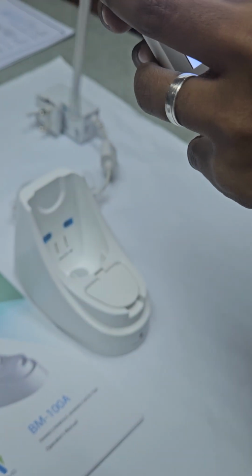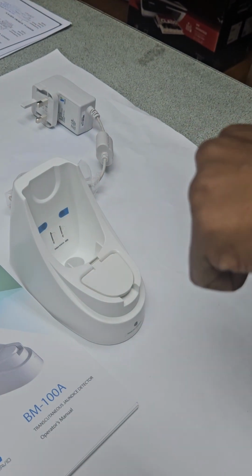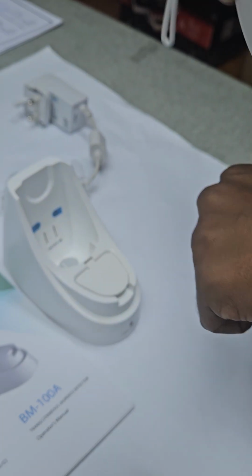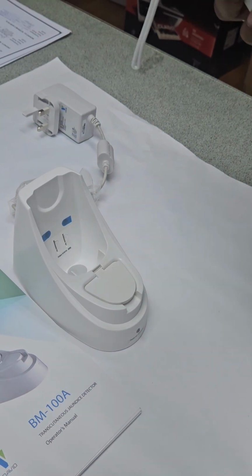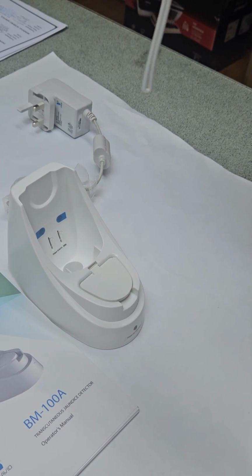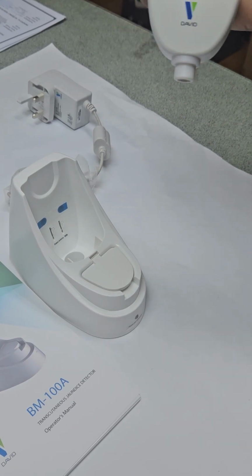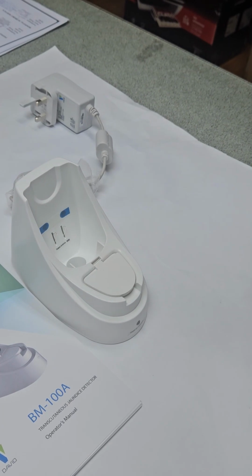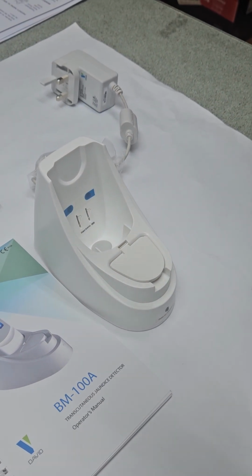Yeah, there's an indication here. After 8 hours, a full charge can be used for 2,000 times. Wow, 2,000. Normally, because some users, some nurses, don't know when to charge, we say to leave it charging at night after use, so in the morning when we want to use it, it's ready. Maybe 2,000, or 3 months per charge.